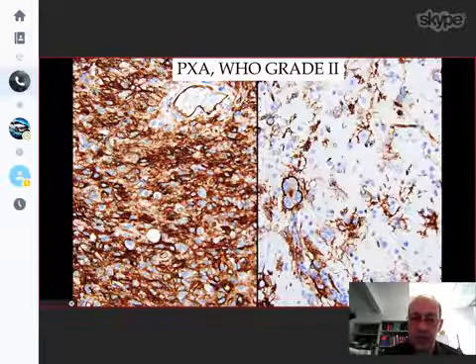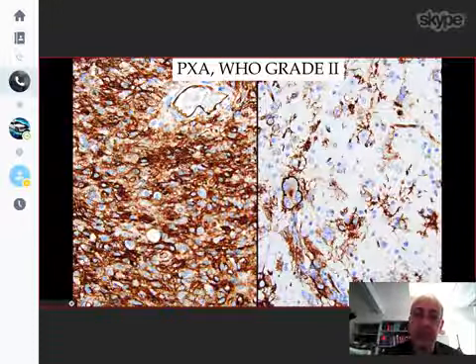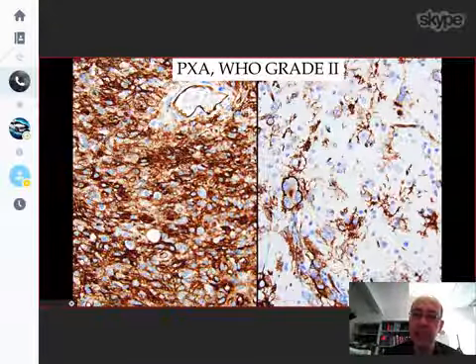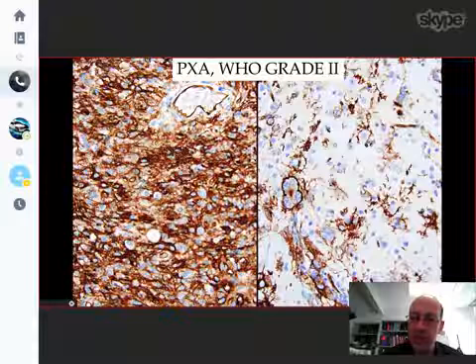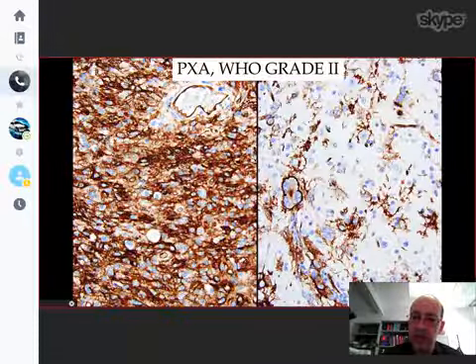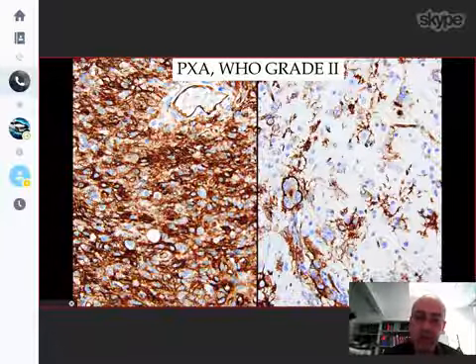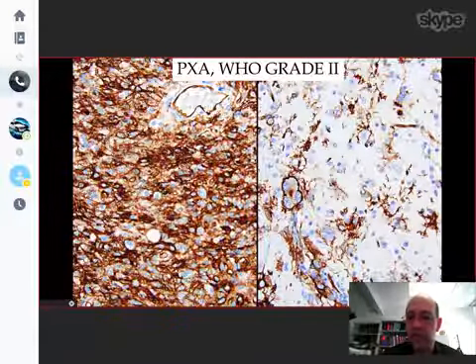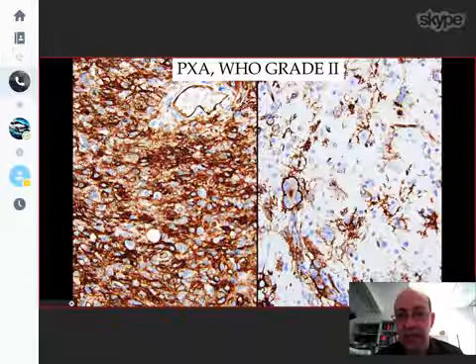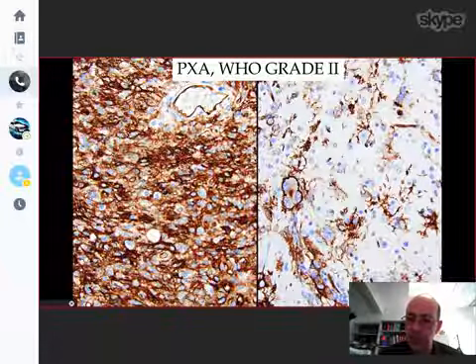The German neuropathologists have identified that very frequently you have a lot of CD34 positivity in these tumors, either in the tumor cells themselves or in adjacent cortex, often where they have these spider-like ramified processes coming out of these cells. It's not absolutely specific, but very common in PXA, as well as in ganglioglioma, and some forms of focal cortical dysplasia will have that as well.